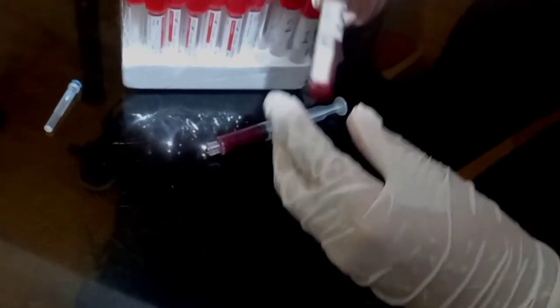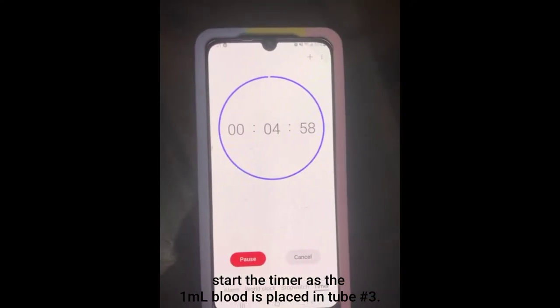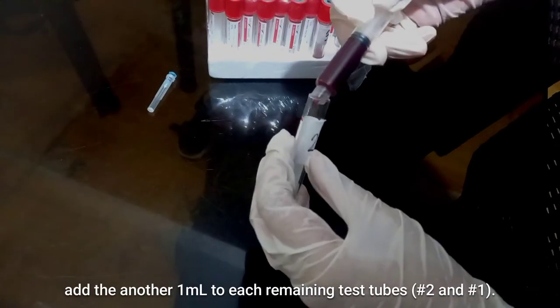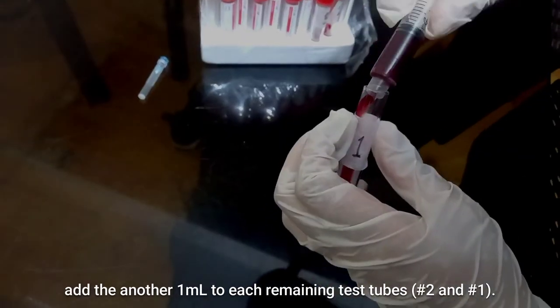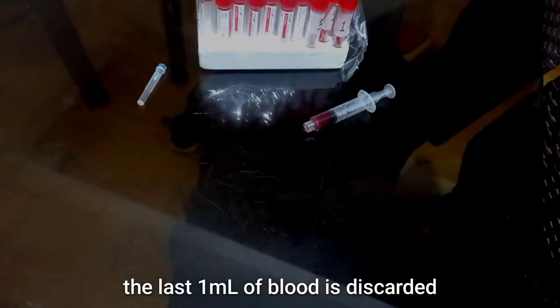Set the timer to 5 minutes and start as the 1 ml of blood is placed in test tube number 3. Add another 1 ml each to test tube number 2 and number 1. The last 1 ml of blood is discarded.